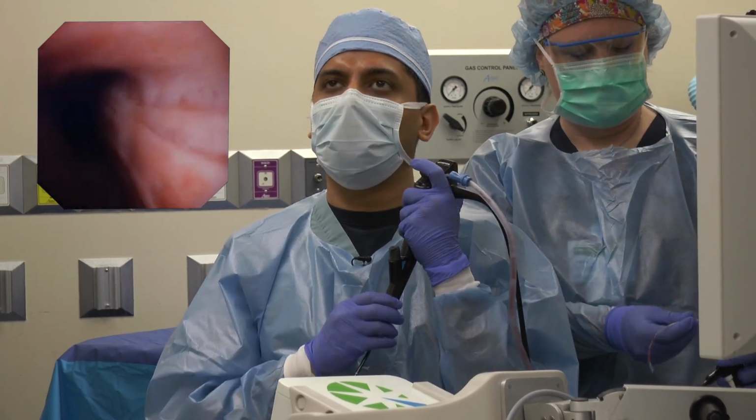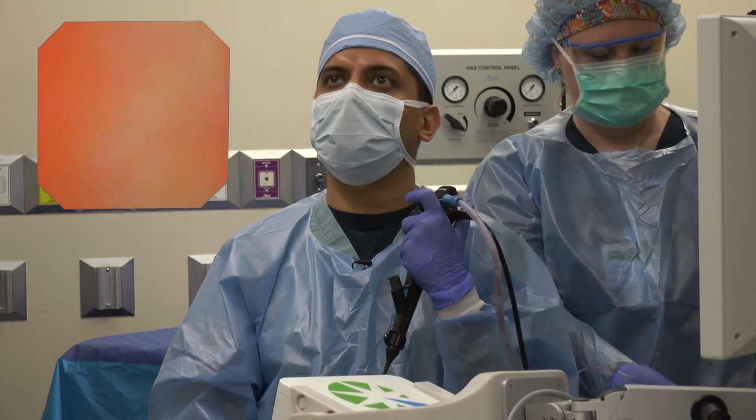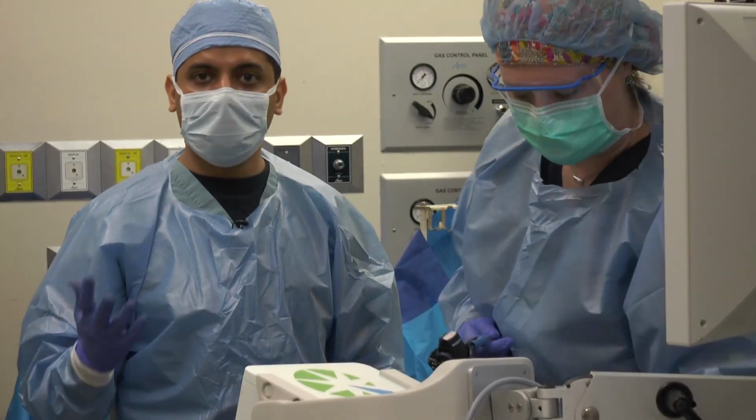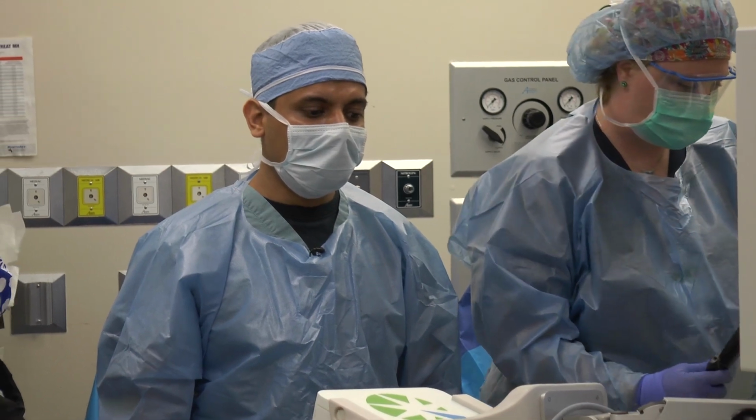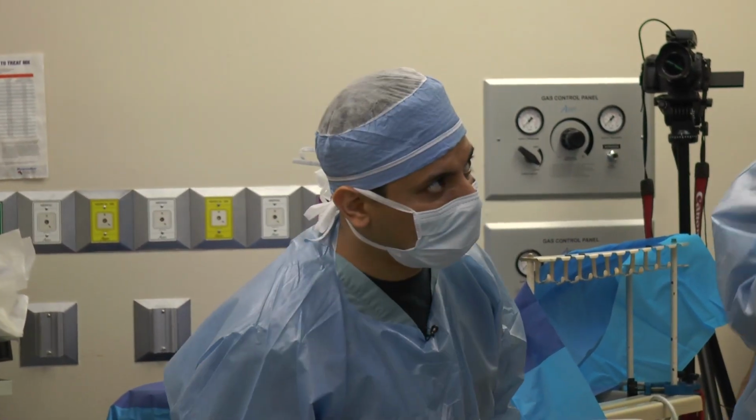So it's called the Hawthorne effect. Yeah, your performance improves when you're being observed. So we got 3 fiducials in around the nodule, and that's it. We are concluding the procedure. What's the stop time?